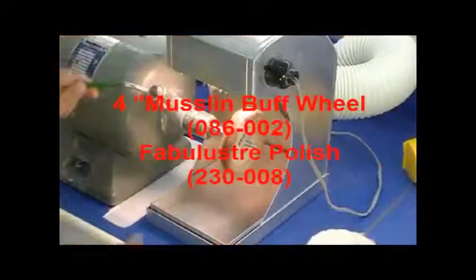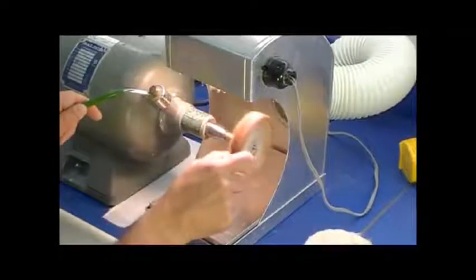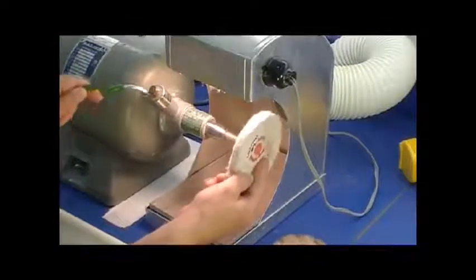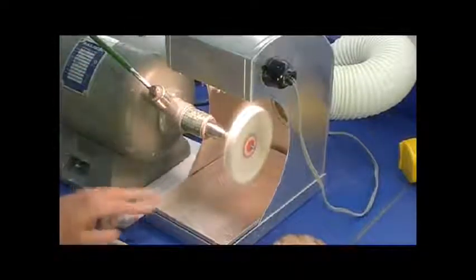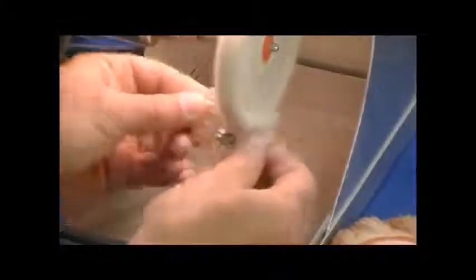Place a 4-inch loose muslin buff onto the threaded mandrel on the low-speed quick chuck lathe. Apply Fabuluster polish to wheel. This polish shines the plastic. Press the appliance lightly against the wheel to apply the Fabuluster polish.